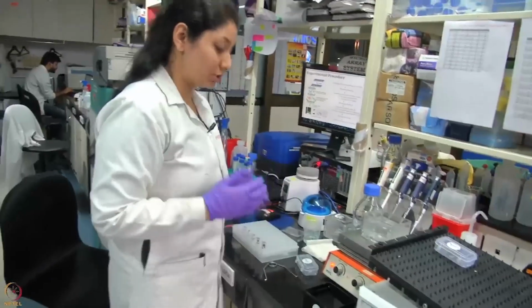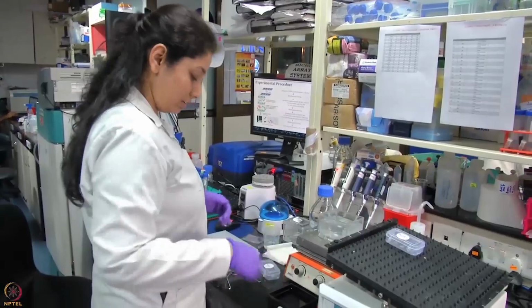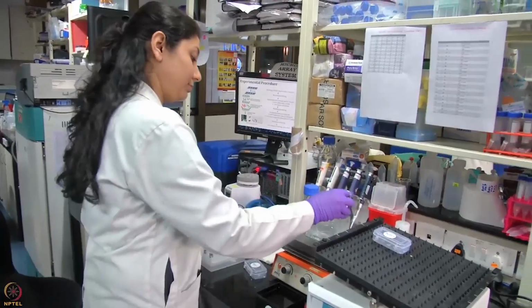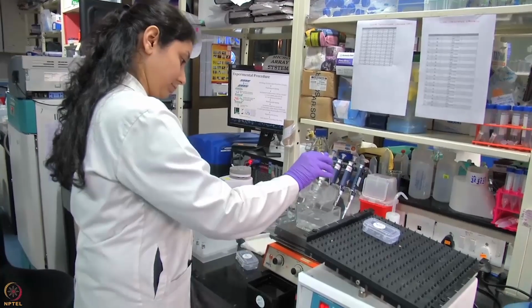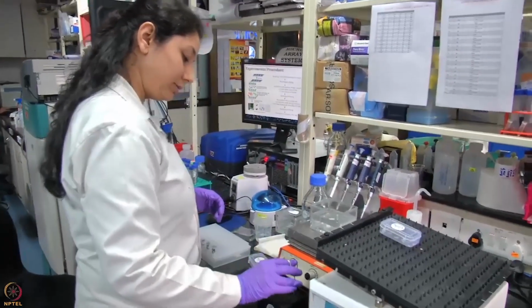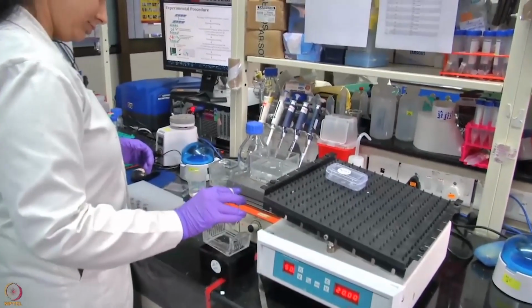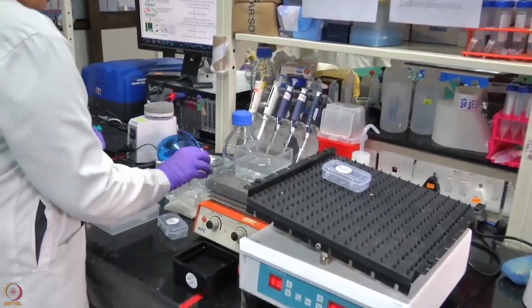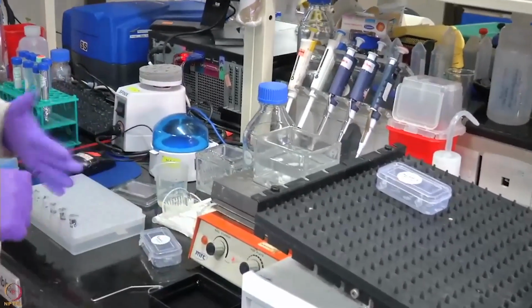So once this washing is complete, 3 times 10 minutes, we will again remove the cassette, rinse it with water to remove the extra buffer, and spin it for 2 minutes at 900 RPM.